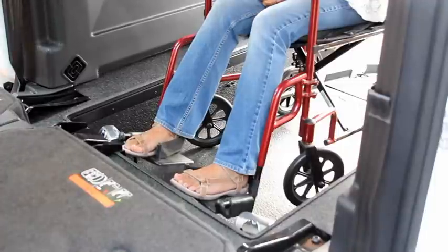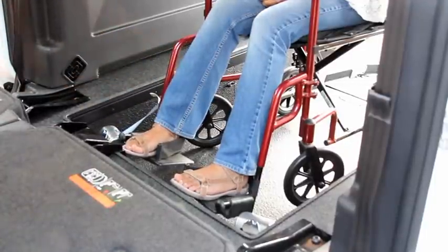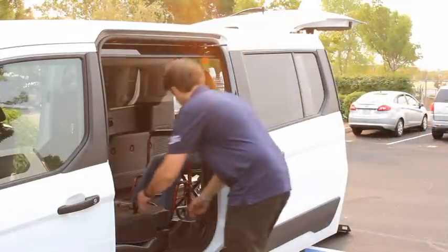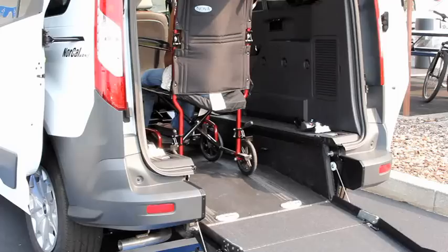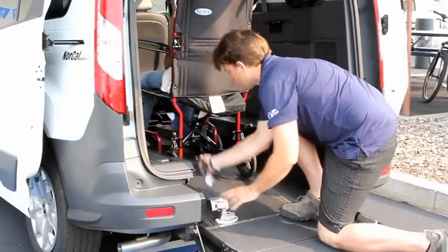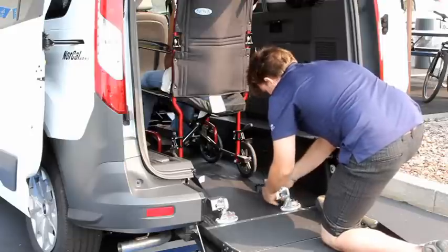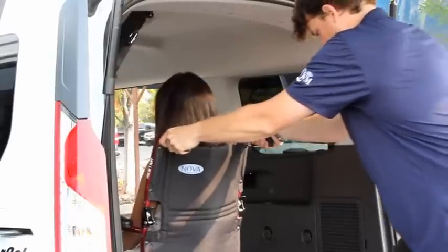Access the tie-down through the sliding door. Hook the front tie-down to the appropriate place on the wheelchair. Now go to the other side of the vehicle and attach the second tie-down to the wheelchair. Return to the rear of the vehicle, secure the tie-downs into the floor slots, and attach to the appropriate points on the wheelchair. Verify that the tie-downs are snug.